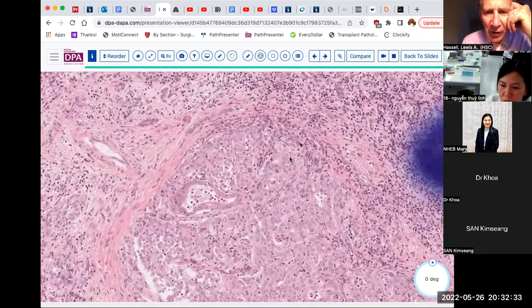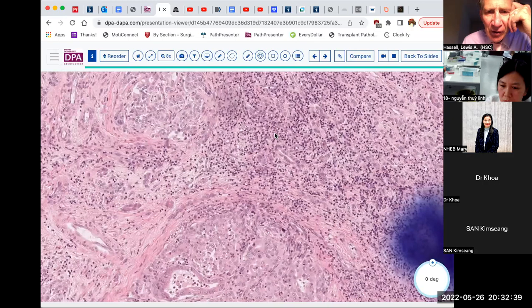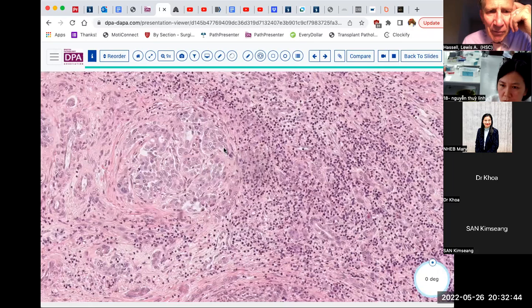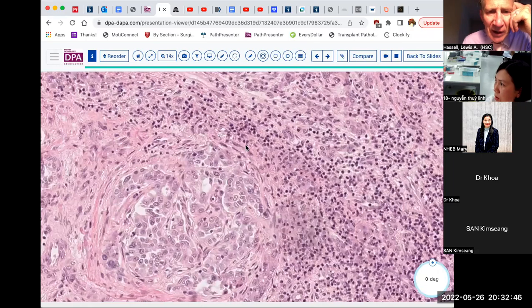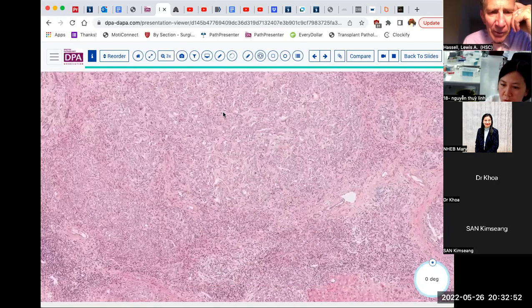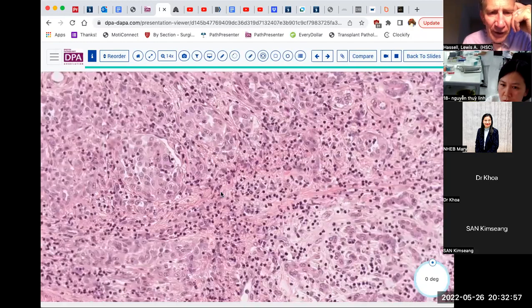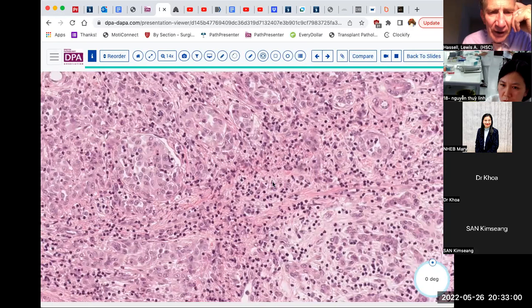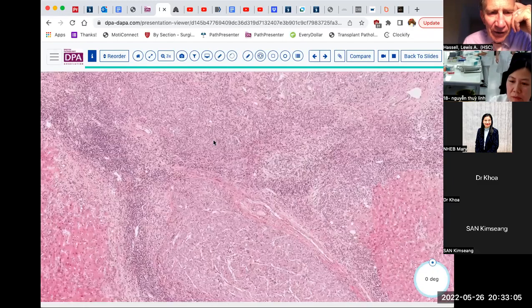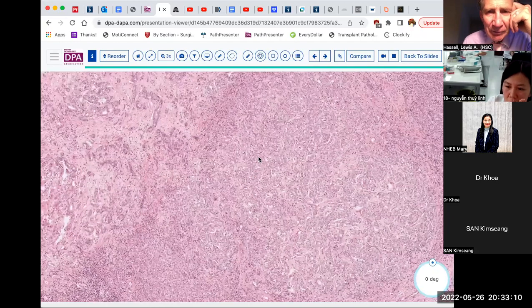And so while we're not confident that these tumor infiltrating lymphocytes are associated with mismatch repair defects or whatever, they might make it worth considering that possibility and potentially doing evaluation for mismatch repair defects to see if the patient might therefore qualify for immunotherapy, which can be quite dramatic in terms of responsiveness in those tumors where it's the dominant molecular pathway that's being upset.